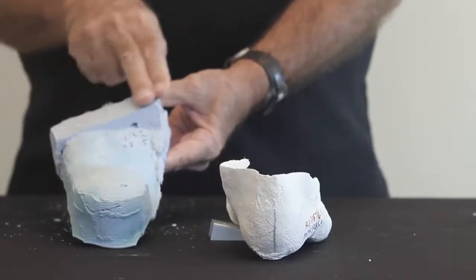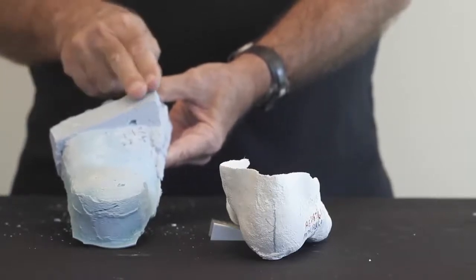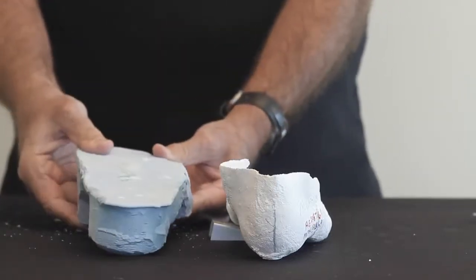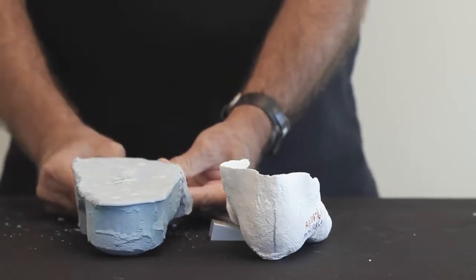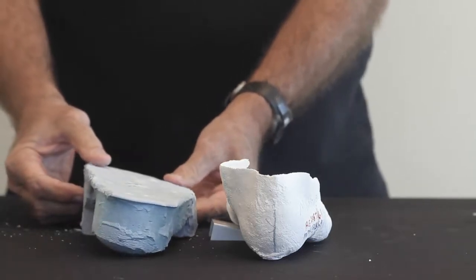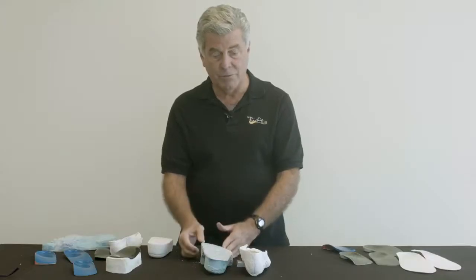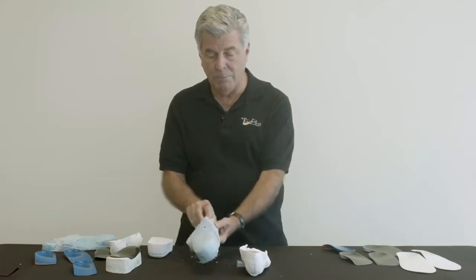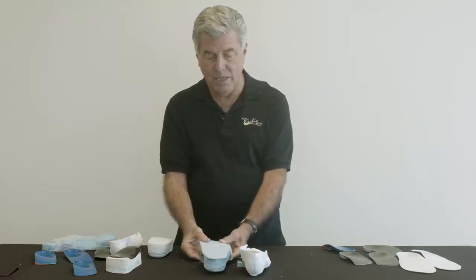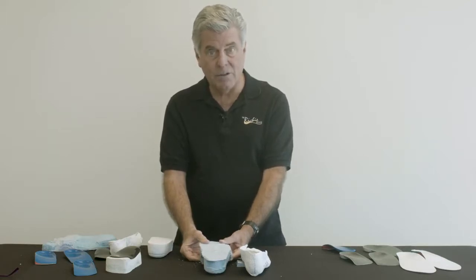The lab will add a forefoot platform across the weight-bearing surface of the forefoot, such that this platform will orient the rear foot either in a perpendicular attitude, or — in this particular case — this is a Blake modification, where the practitioner actually wants the cast to end up being inverted, which is an extra correction to control pronation. It's all accomplished by this platform, which balances the cast either perpendicular or to the degree the practitioner designates on the prescription form.